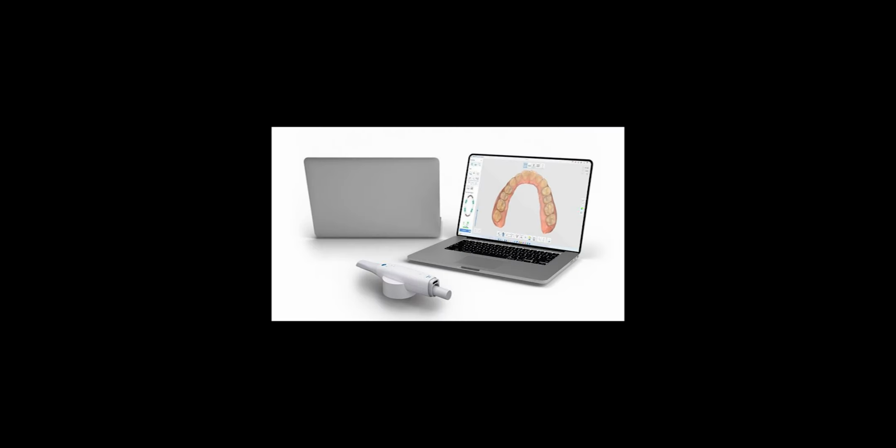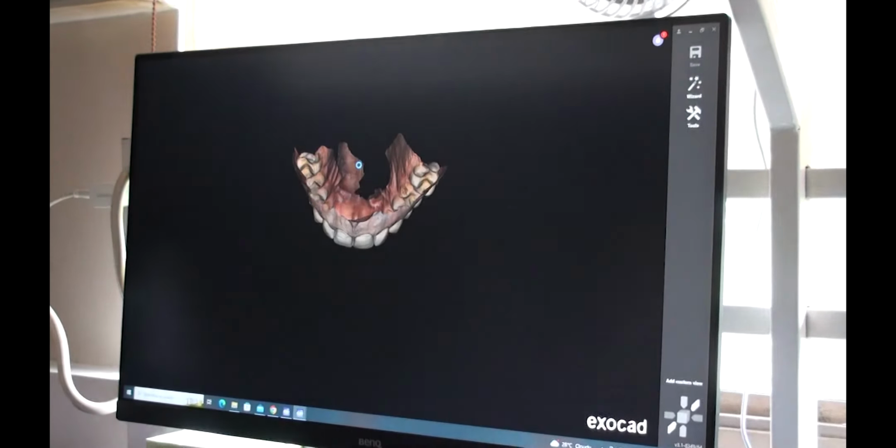So to minimize all those, here's what we can use. Yes, a scanner. So in this section, we're going to look at what goes on between actually scanning a patient and actually producing the dental prosthesis. Now, the scanner helps us to directly go from the mouth, an image is generated and it's sent off to the lab directly. So let's see how that works.